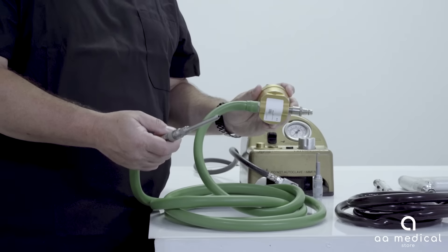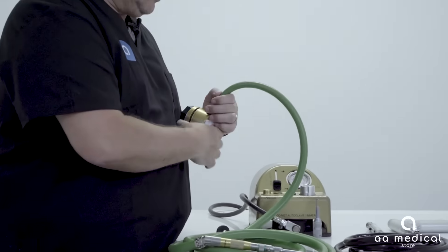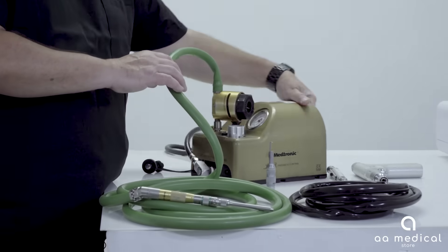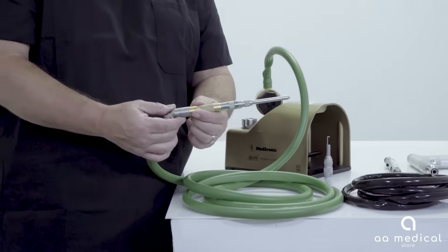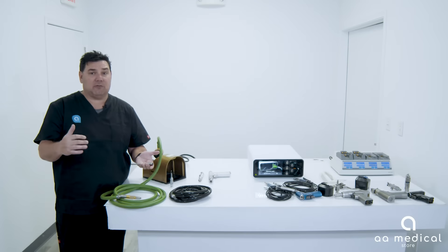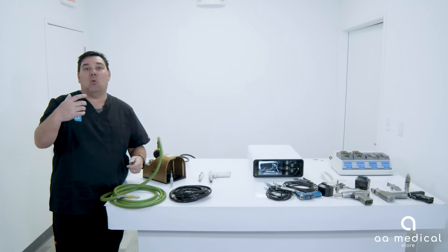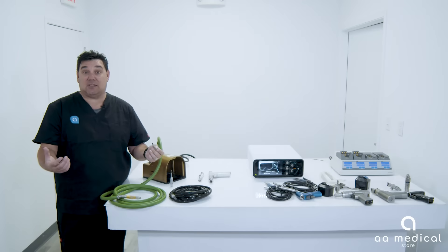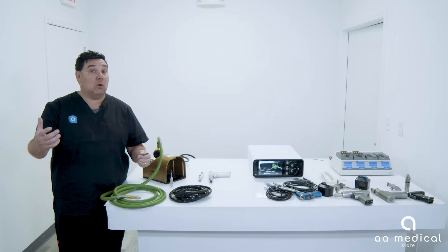The components of the Midas Rex system include the hand piece, the plug-in, and the nitrogen cord. You also need a foot pedal to run it — the nitrogen is supplied through the foot pedal, which is the power control for the surgeon. The hand piece requires an attachment, and Midas Rex makes many different attachments depending on what style or type of burr you want to use with the system.